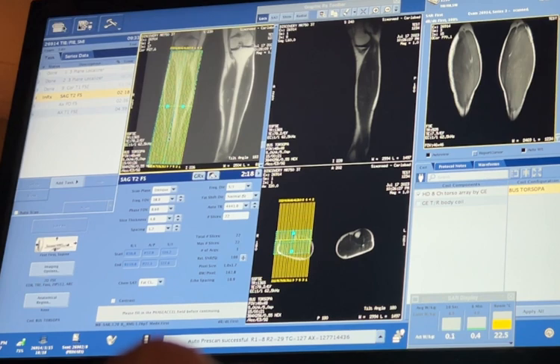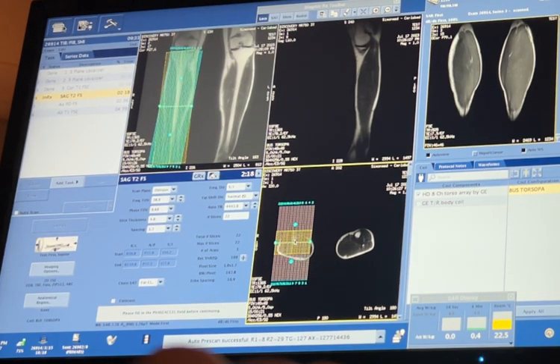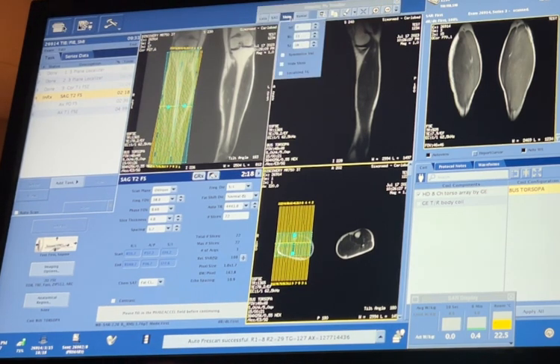It's hard to see with the slices. That's because you're not going to hide the shim box. That's good. So now you can move it posterior slightly on the axial. Grab the shim box. The shim is neutral. Perfect. Now you can hide the shim. Perfect. And now we can add our slices.